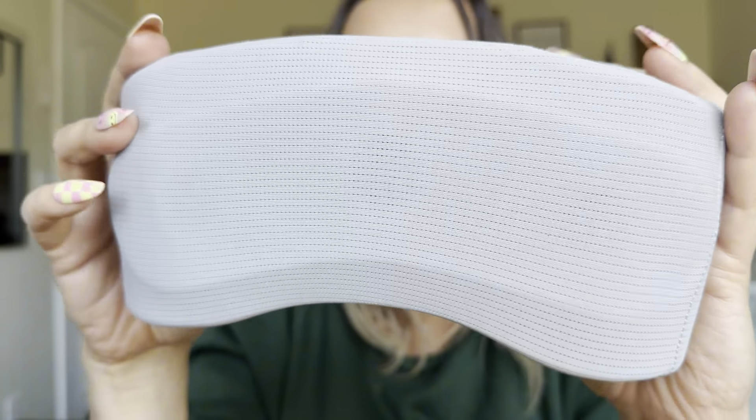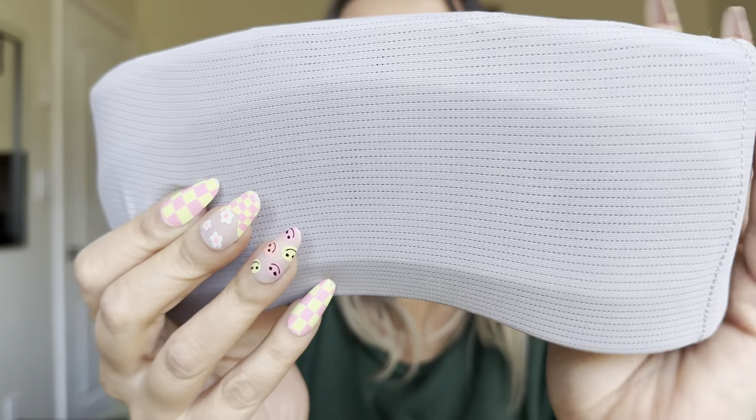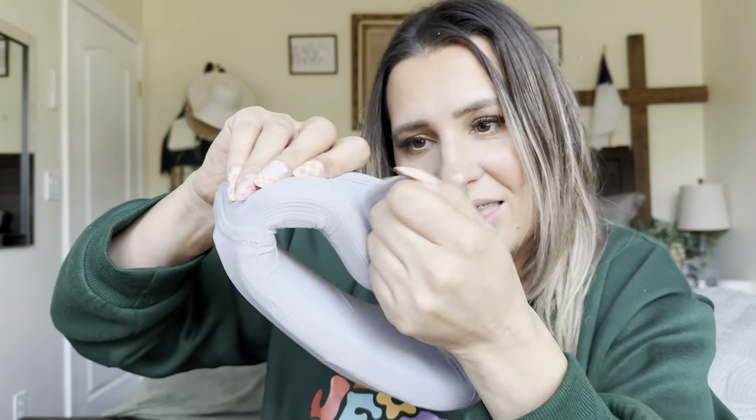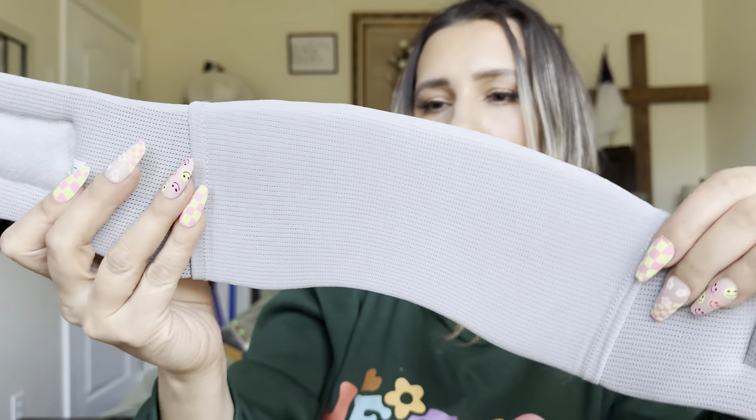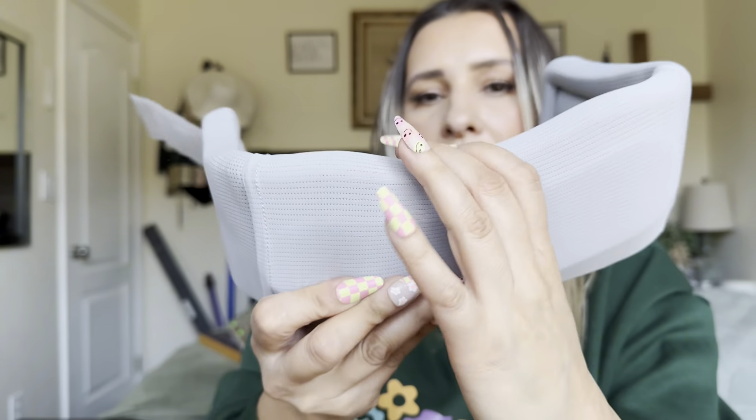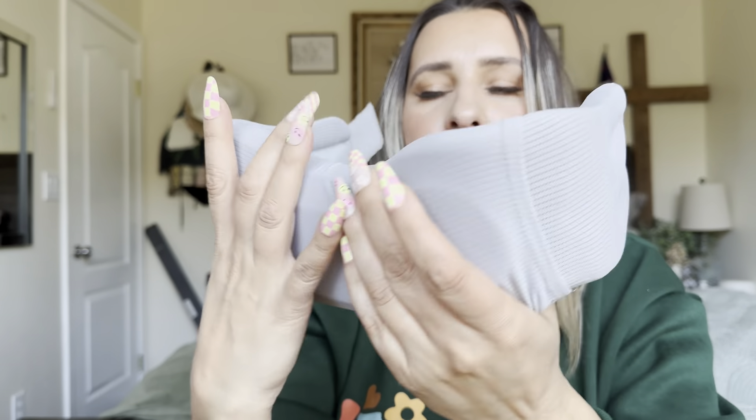This is what it looks like. It's actually a very soft material on the outside. It has a really thick, nice strap so it will stay on there nice and well. It has these little holes that will allow it to breathe — nice and cushiony.